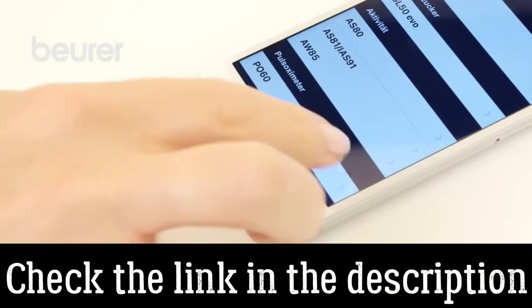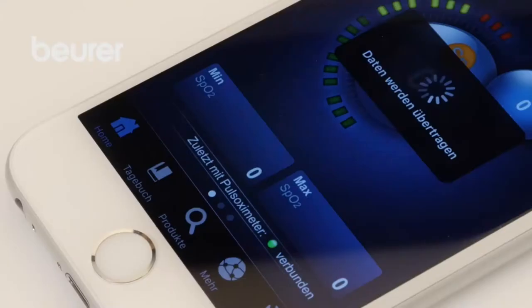Add the PO60 in the app settings. The measured values can only be transferred when the Health Manager app is open.